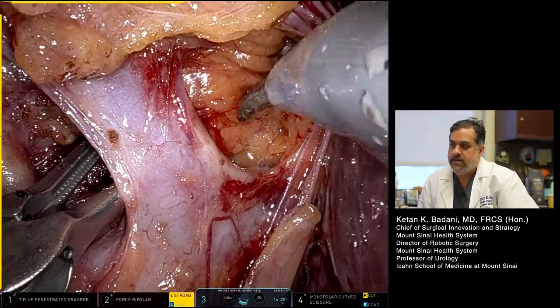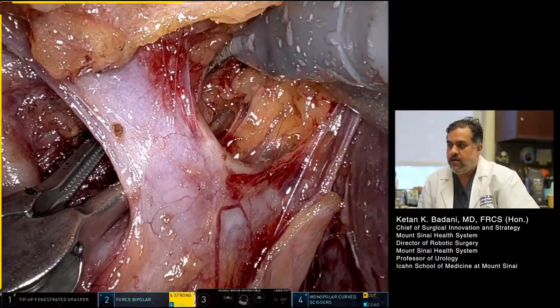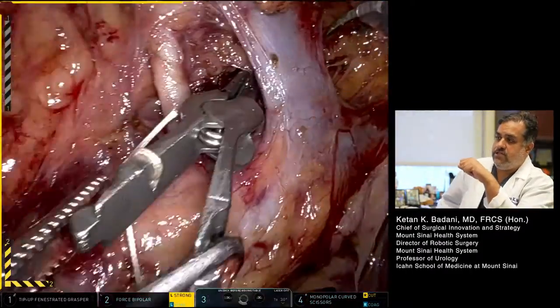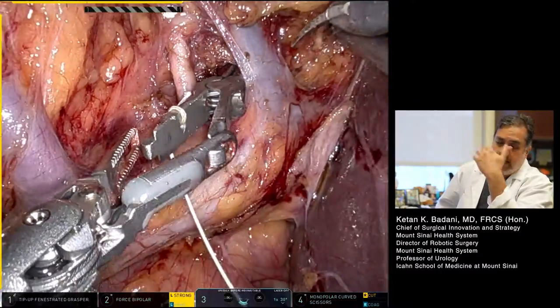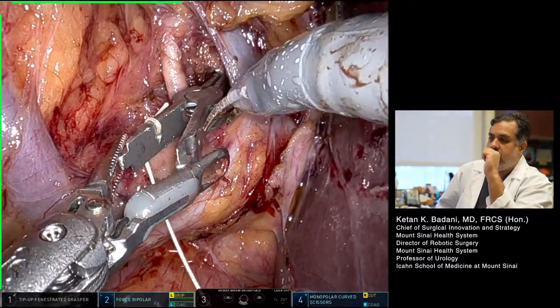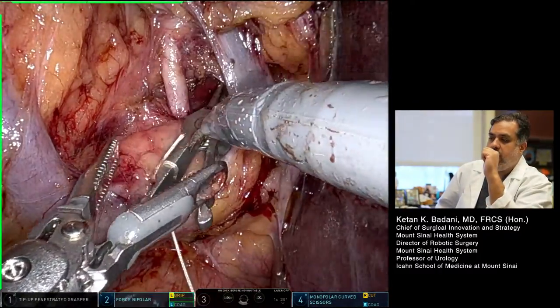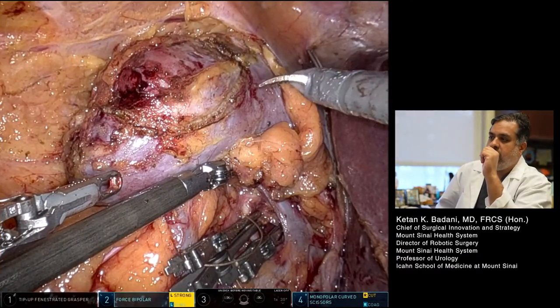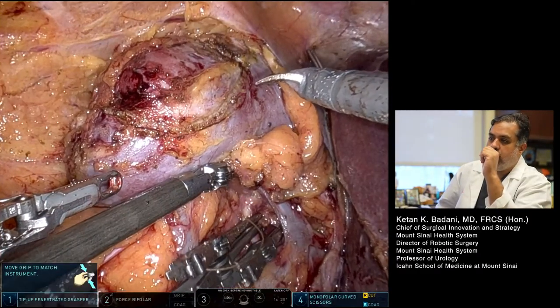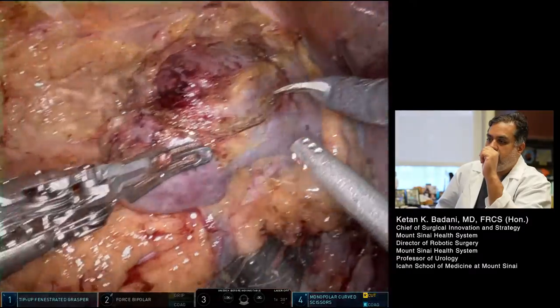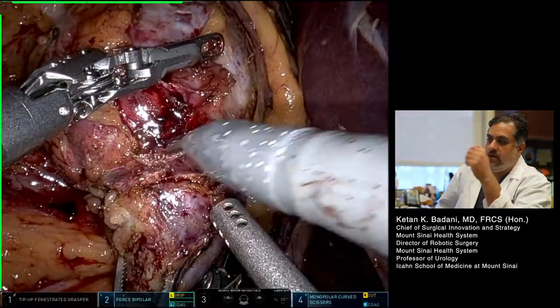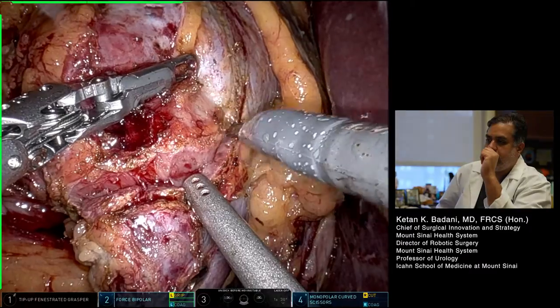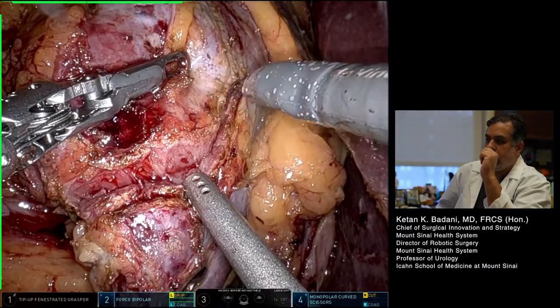I'll place the clamps now. At this point you can make sure everything is set at your table-side assistant for clamp time — that could be your sutures, the bag for bagging the specimen, the bulldogs. We do run a quick check before we clamp. Both renal arteries are clamped and we can go to the excision.